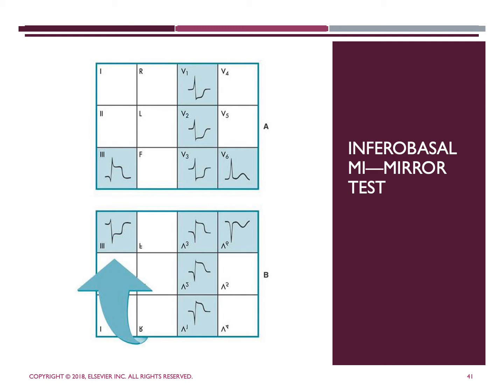In figure A, the top picture here, what we're looking at is a schematic 12-lead ECG with indicative changes of inferior infarction in lead 3. What I really want you to note here is the tall R wave in lead V1 and the ST segment depression in leads V1, V2, and V3.